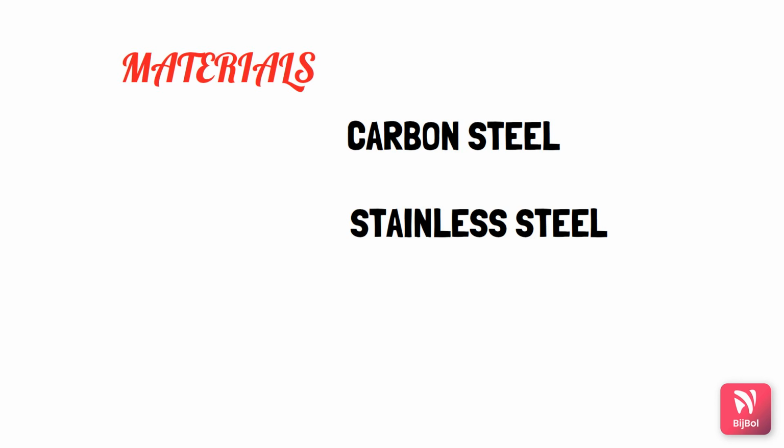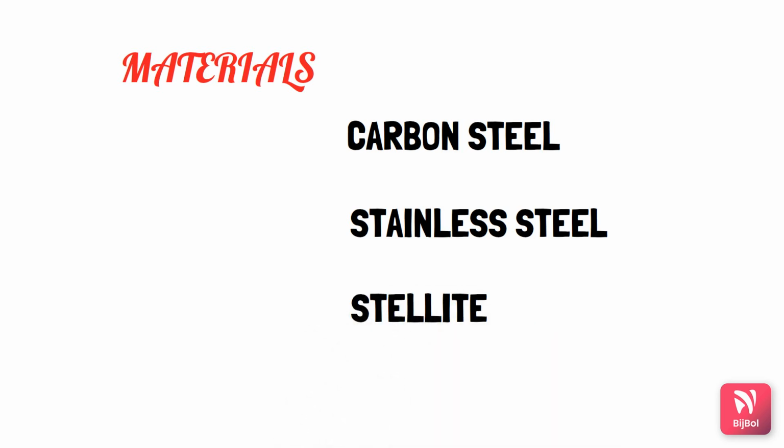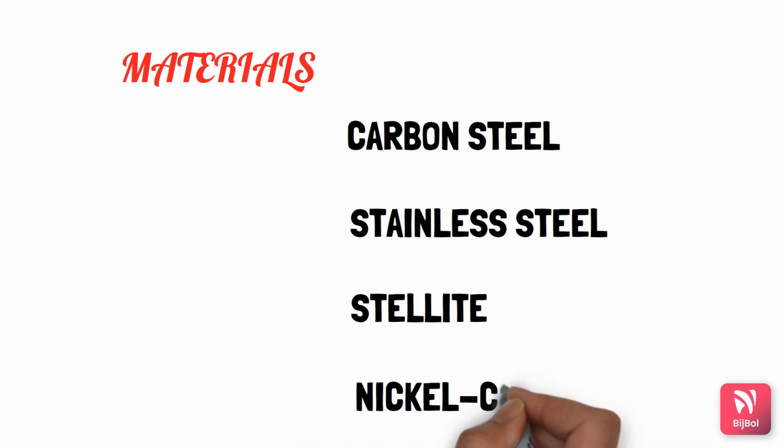But we have other instruments such as Stellite material, which consists of cobalt and chromium, and is highly resistant to acid and hardness. But in newer technology, we use the nickel chromium instruments, which consist of nickel, chromium, and iron, which has high resistance to degree of temperature.